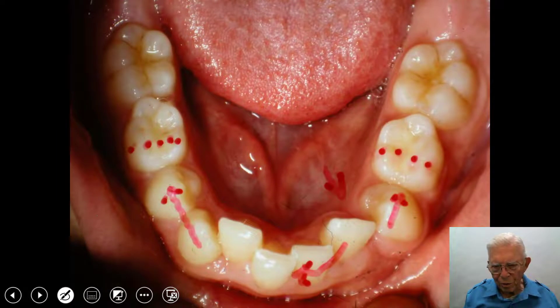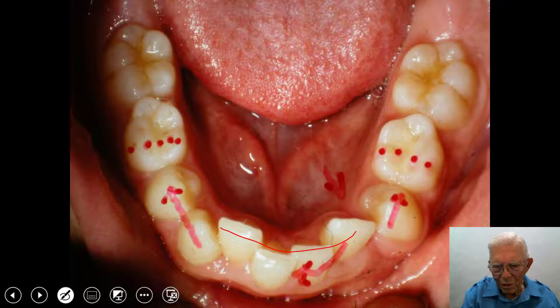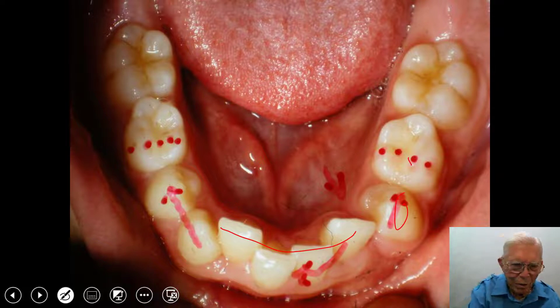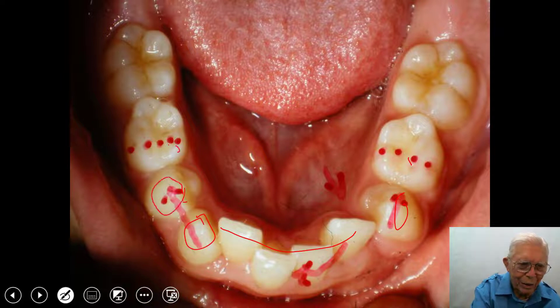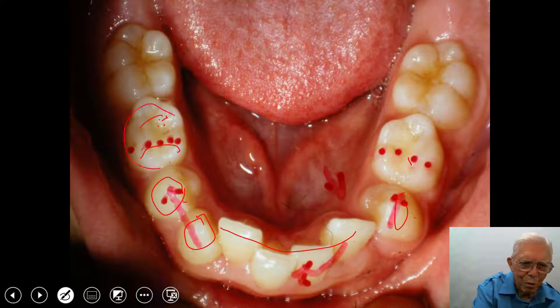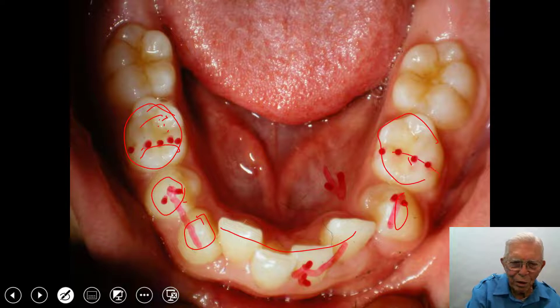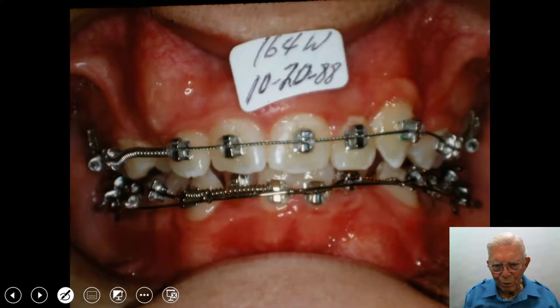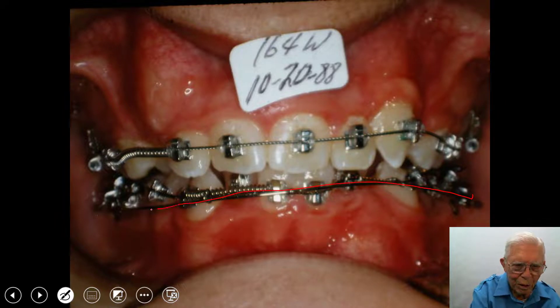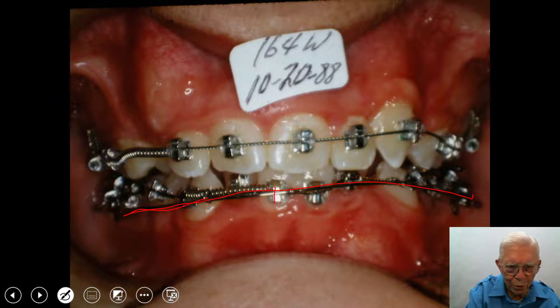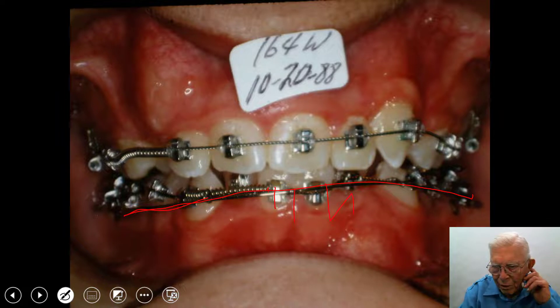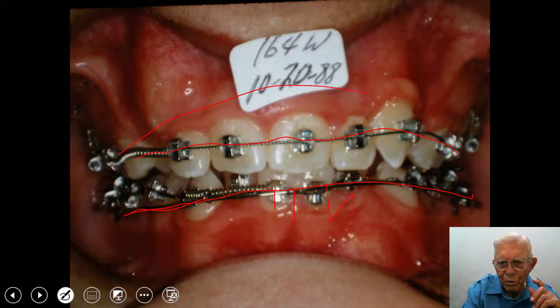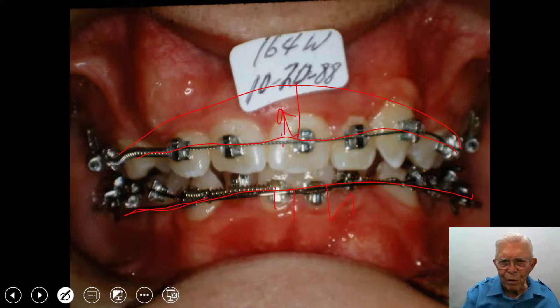Down on the bottom, we've got a crowded problem here. This is a bicuspid, there will be a bicuspid here, this is the cuspid and a bicuspid, and then he's got a deciduous molar here that we'll have to either take out or remove part of it to get the bicuspid to come into that area to get the space. Just working out the space problem is going to be quite a challenge on this young man. We put a large arch wire in here to expand the lower arch, and it's also an intruding arch which will bring these lower teeth down. We really should also have an intruding arch on the upper, bringing those teeth up in that area.